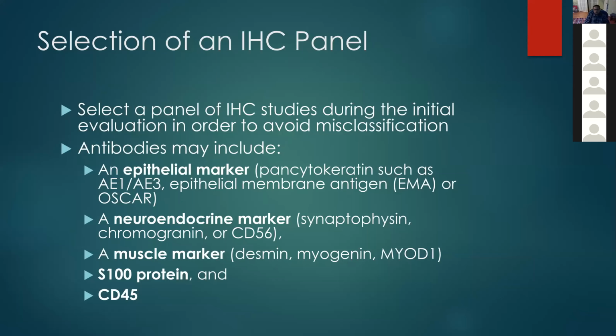So anything with a double plus is very strongly reactive, okay? Then let's come to melanoma. Look at that, S100, strongly reactive. So look at that, you've already isolated leukemia, lymphoma, synovial sarcoma, rhabdomyosarcoma, and you will get neuroendocrine carcinomas also by using a CD56.